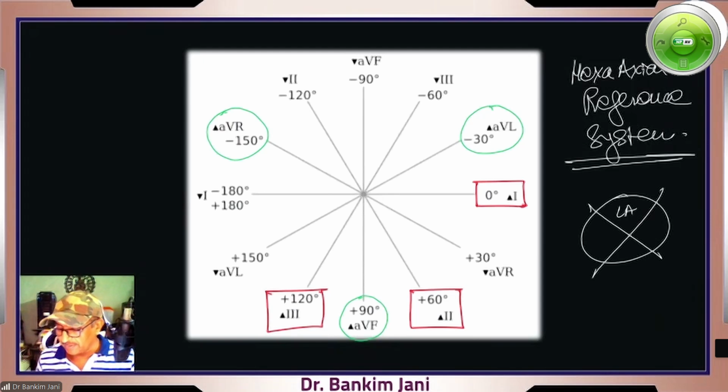So here is the left atrium. So here is the esophagus. From the esophagus, the lead comes over here, and then you are taking the ECG. Right? They are all special cases. But yes, you are right. In the current system, for the left atrium, you will not be able to see it as well as compared to others. Though there are methods, but yes, I got the point. What you are telling is very right.